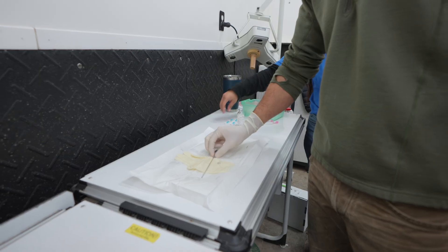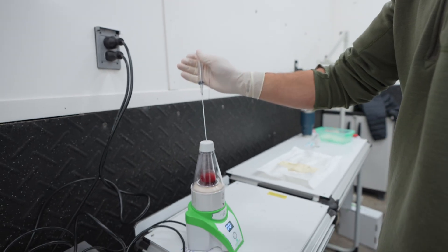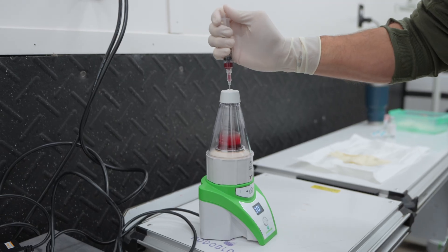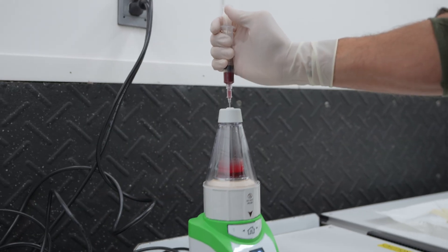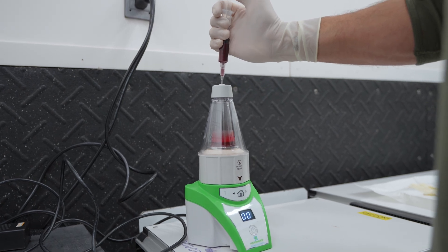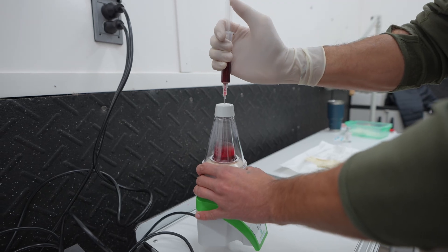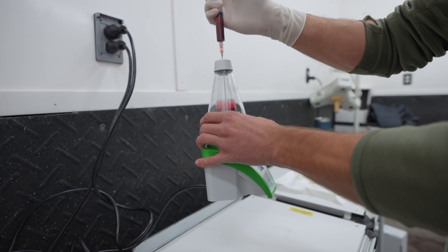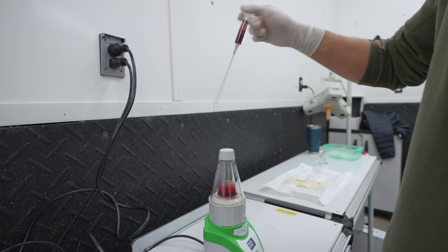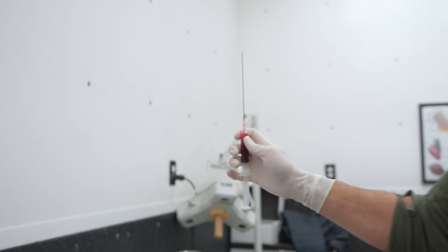This is what we're going to use — we pull up our PRP product from the bottom of the centrifuge system. I wiggle it around to make sure I'm getting every little bit for the most bang for the buck. With these kits you typically get anywhere from four to six cc's — she gave us right about five, a little over five. This is the product that will go right back into the coffin joint we're treating.